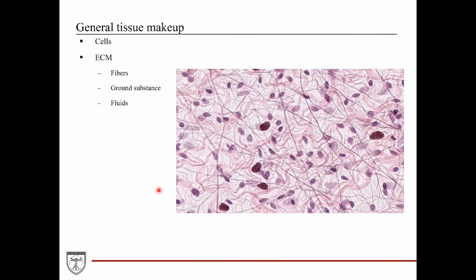And the third type of fibers, the reticular fibers, you'll just kind of have to trust me. They're here in this field, but unfortunately, reticular fibers are so thin and fine, sometimes they don't stain well with typical stain, so we have to apply special staining techniques in order to see them. So for now, trust me, reticular fibers are here.